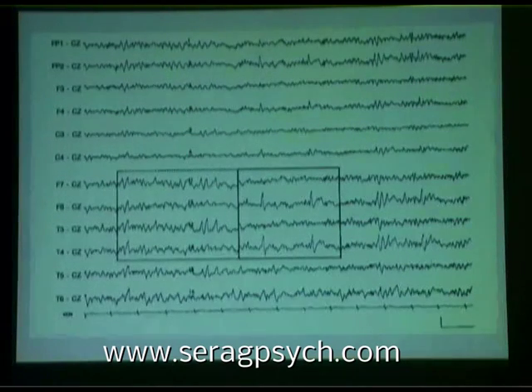Next, please. And now, just to show that this isn't all that easy, here are some temporal spikes that look a little bit like small, sharp spikes, and they have a bit of a wide field as well, but it's really all unilateral here. And this is another good montage, actually, CZ for temporal lobe, because it's far away from the temporal lobe.